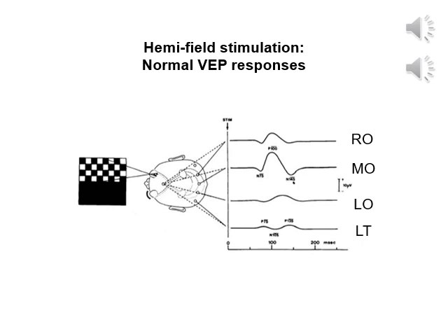So we're going to start at the left side of this picture where we see the checkerboard, and you'll note that the checkerboard is on the right visual field. It's on the right side, and so it's a right visual field stimulation. Stimulations of the visual fields cross over to activate the opposite retinal fields. And so this right visual field stimulation activates the left retinal field of the right eye. And so in this picture, we see that the right eye is the one being activated, and it's the left retinal field of the right eye that's receiving the right visual field stimulation.